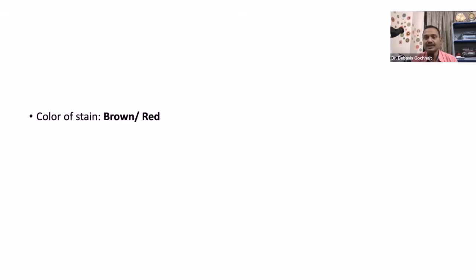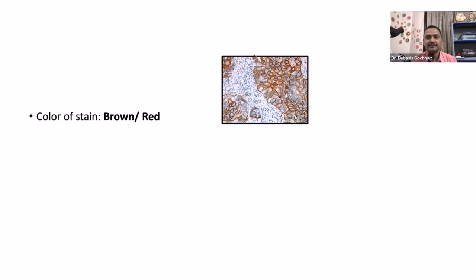Now in immunohistochemistry, I showed you a picture that was looking brown, right? Like this. Now this brown color is because of the chromogen. We use a substance which will be visible to our eye. After the staining, we observe the IHC slide under a routine or compound microscope.